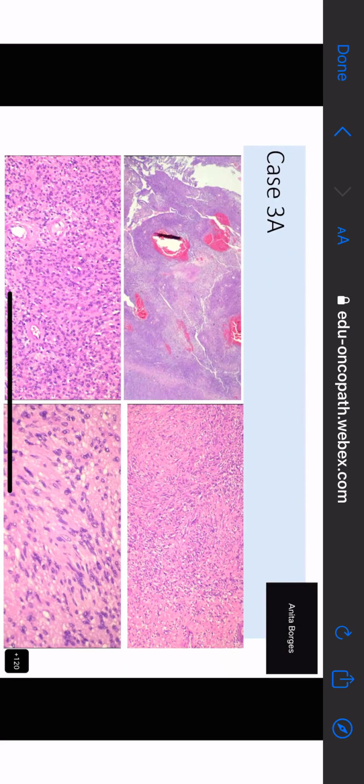No, sorry. Are you saying that this is a lesion with vascularity or is it a vascular lesion? Is it arising from vessels or is it a vascular lesion? A lesion arising from an endothelial cell, is that what you're saying? No, it's not from the endothelial cell. Then when you say it's a vascular lesion, what do you mean? Every lesion is vascular, no?